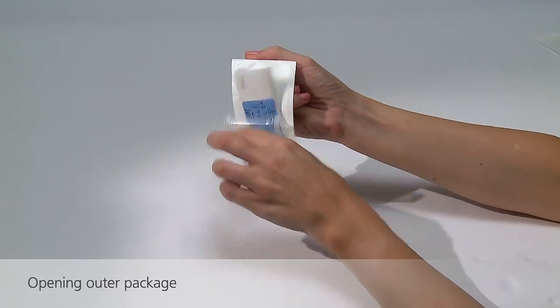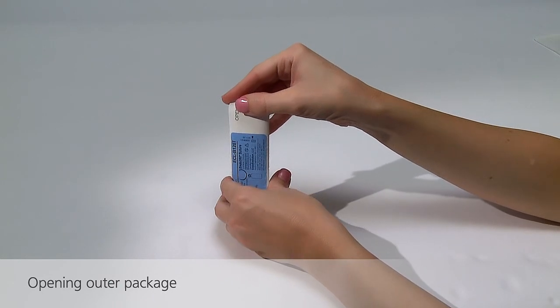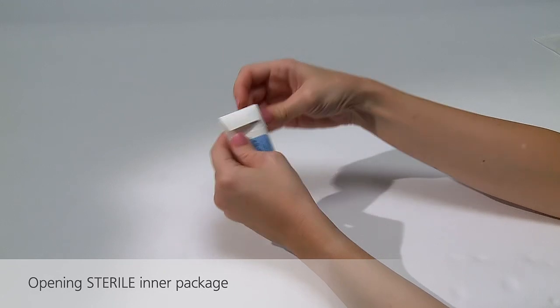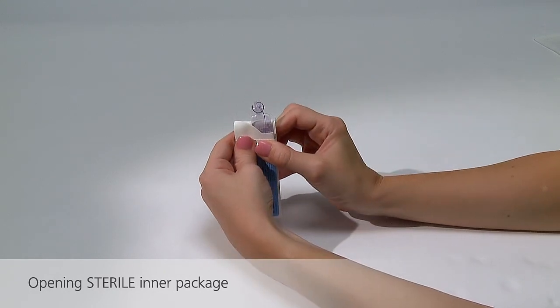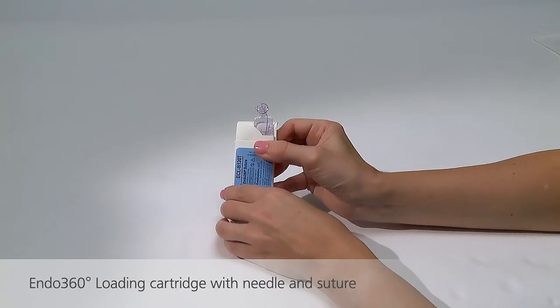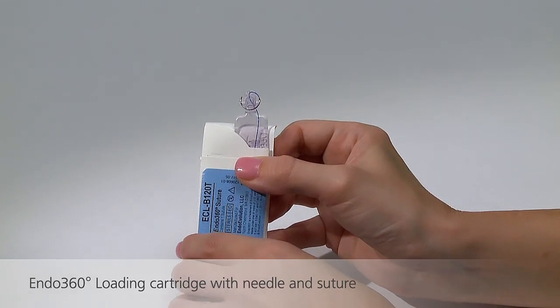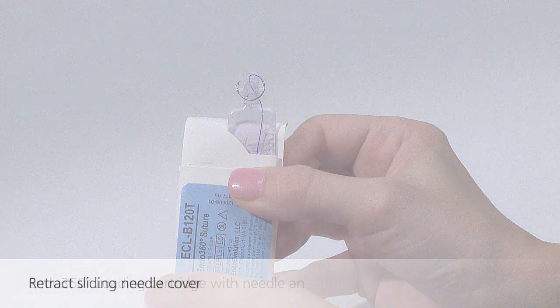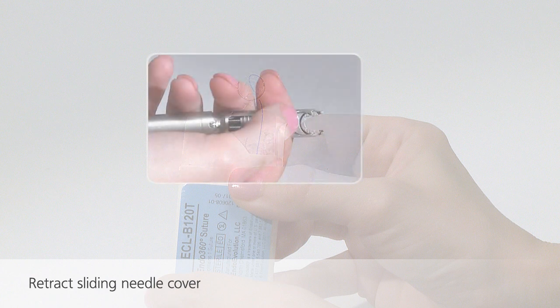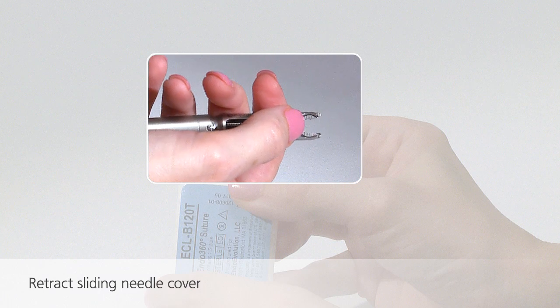The non-sterile outer package and sterile inner package are opened in the usual manner. The sterile loading cartridge with needle and suture is contained within the sterile inner package. In order to load the Endo360 needle onto the Endo360 device, use the thumb to retract the sliding needle cover to expose the needle track.